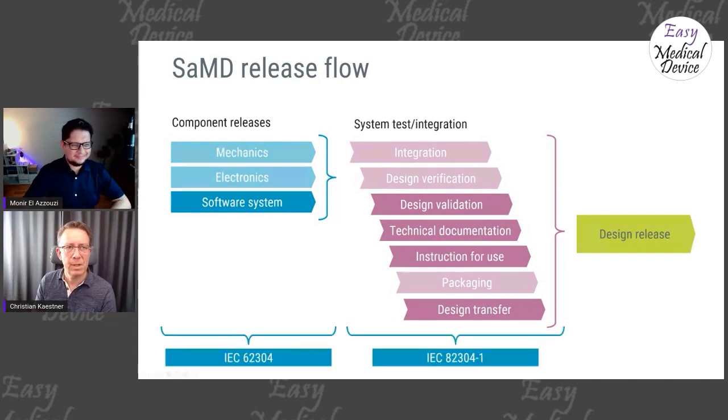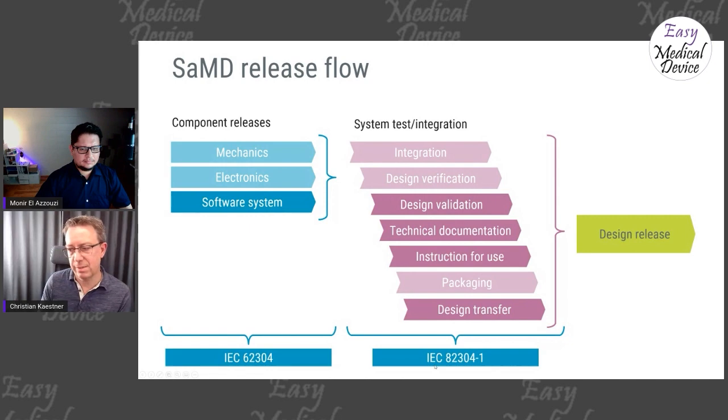Yeah, true. And for your information, the blue parts, this component thing, is covered by 62304. The other parts are covered by the standalone software standard for health software, 82304-1. So they really focus on two different things.